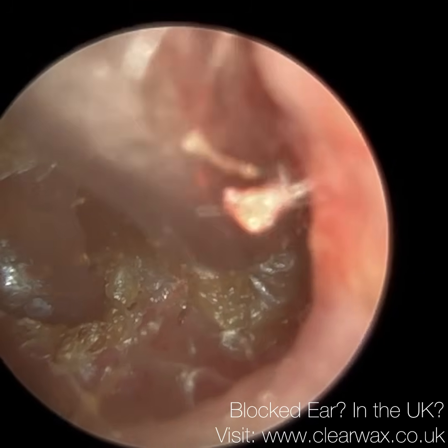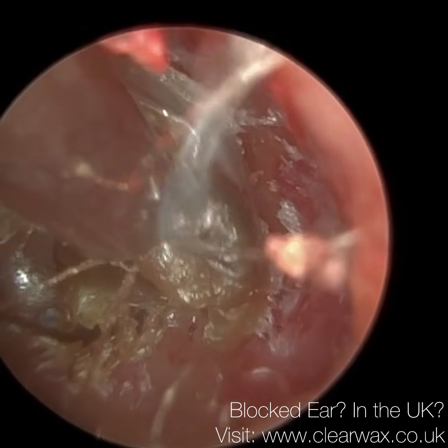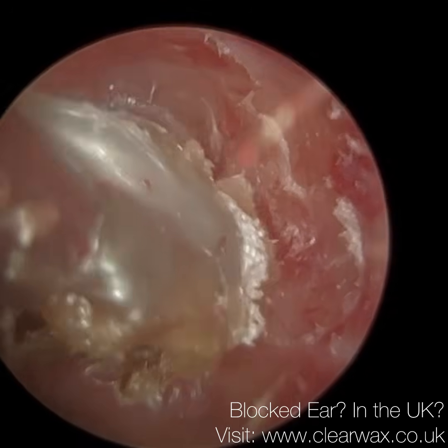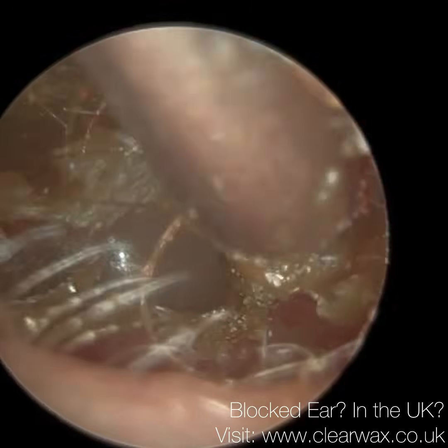And the skin is so adhesive. It's so adhered, it's extremely difficult. In fact, I'm pushing it towards the eardrum in order to lift it up. Now that I've lifted it up, you can see some granulation just on the right hand side, about 1 o'clock on screen, on the edge. So I'm just wriggling this out.